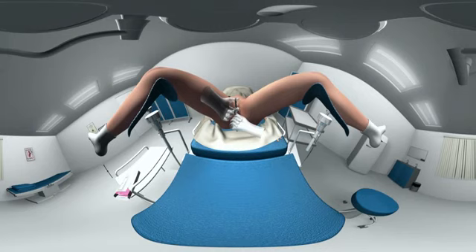Step 5. Release EMILY and withdraw the inserter tube. The threads will release automatically. Check that the threads are hanging freely, 3 cm in length. Step 6. Cut the threads. EMILY insertion is now completed.